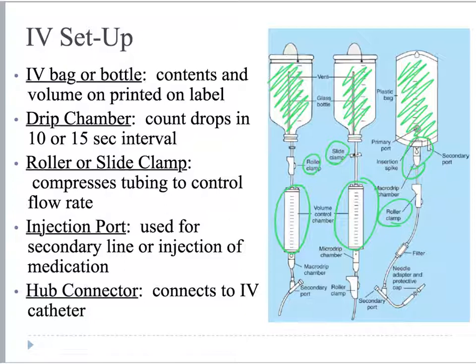And then we have the hub connector, which connects to the IV catheter. So it's just important that you can see the different setups of the IV so that you have an idea of what we're talking about when we talk about the drop factor, the drip chamber, and how to set an IV.